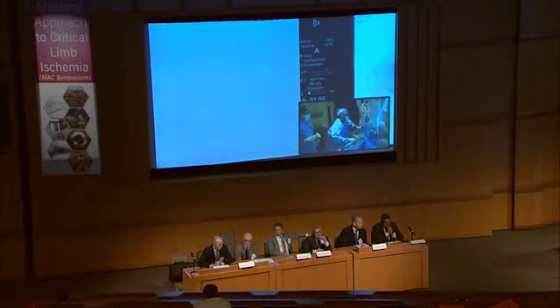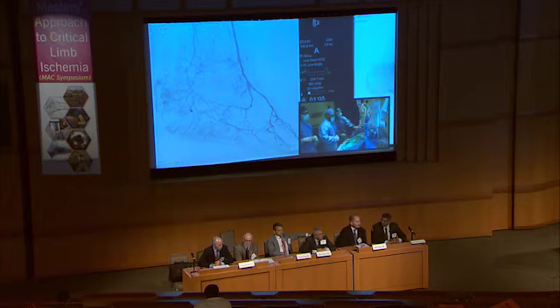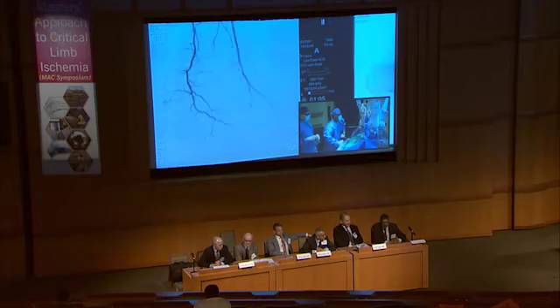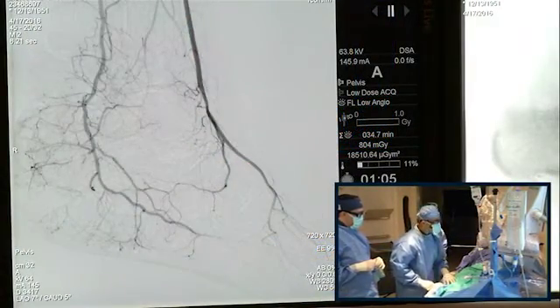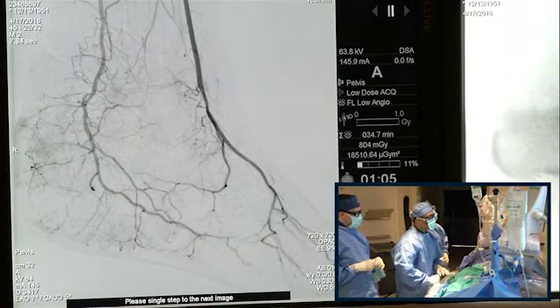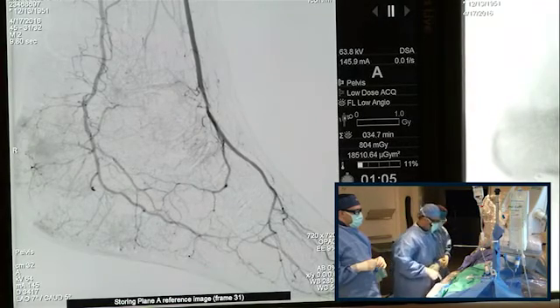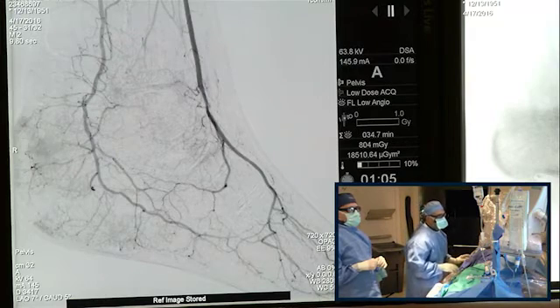Yeah, but he has shown already in the introduction slides that the anterior is a very big artery, as we see it here. This is equally important. Even if the flow is pretty good, if we would have a good durable outcome of the PT intervention, I would stay with PT only, but we don't have modalities at the moment that are really persistent. So the lady has a bigger chance for wound healing if both vessels would be opened. And there's a nice communication.